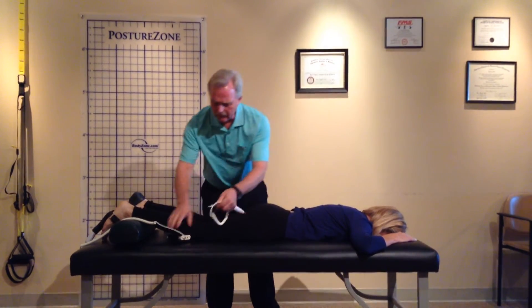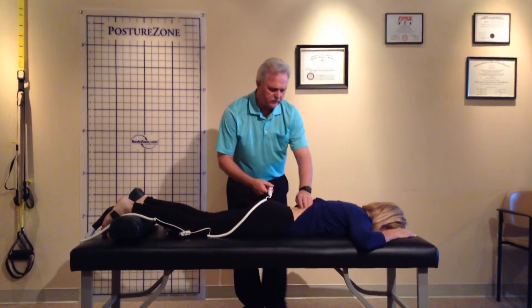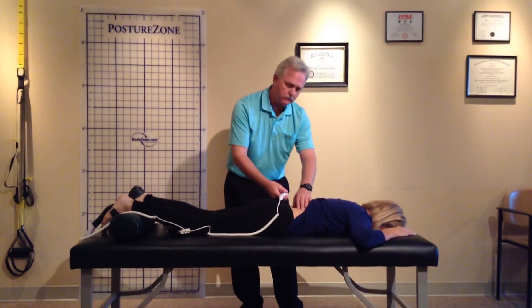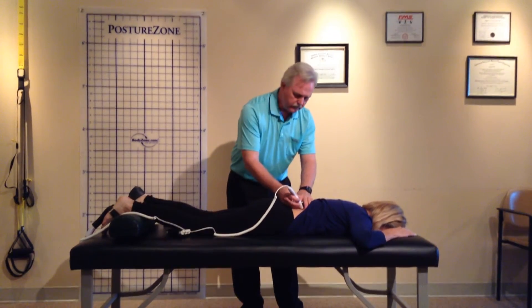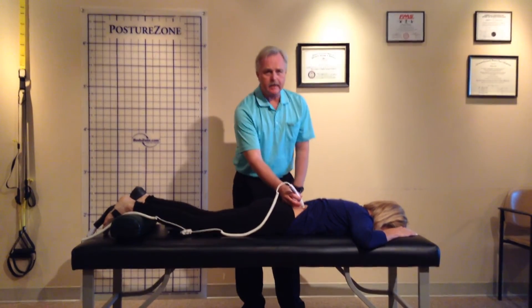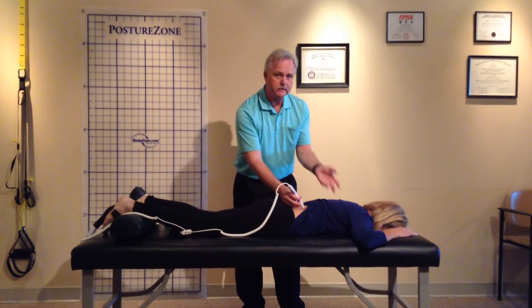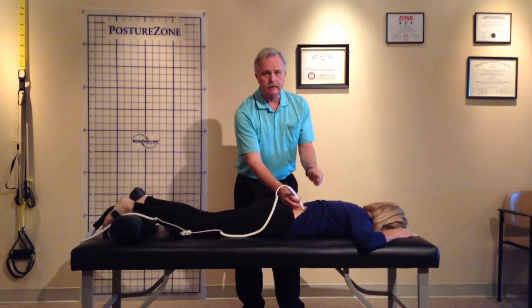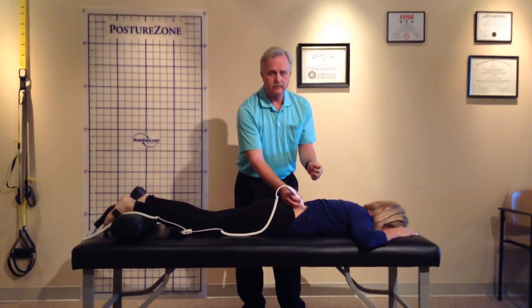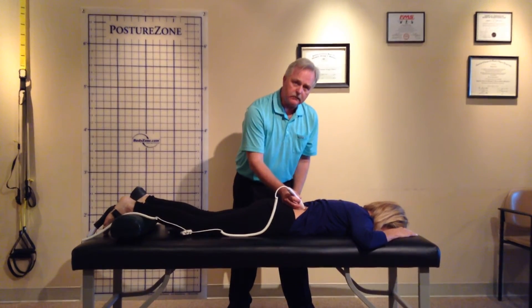I'll show you another feature. We all know that commonly you get trigger points along in this low back area in the quadratus lumborum. Well, you simply put this probe, find the trigger point, put the probe over it, and it actively treats that trigger point. In some cases, from my experience, just melting those points away. The difficult ones oftentimes will make it tremendously better to have treatment for several cycles on that point.